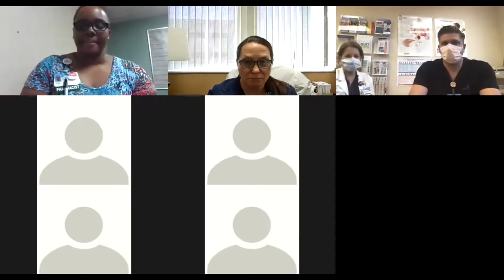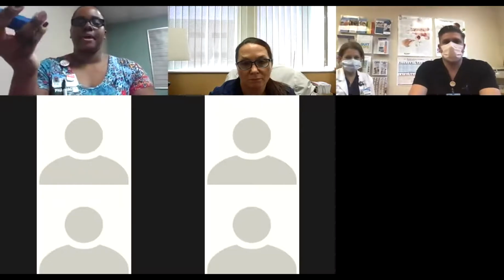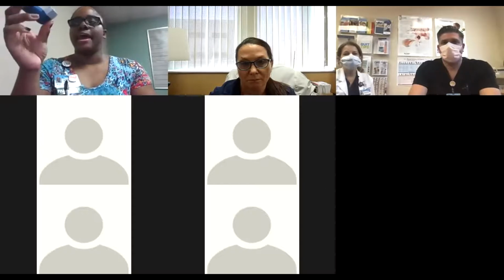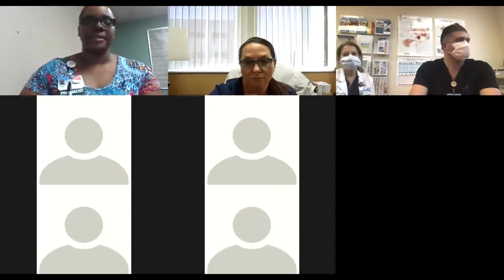And that's pretty much it. That's how you use these inhalers. And you just want to make sure to keep it out of reach of children, obviously. Don't put it in the fridge or anything like that. And just store it at room temperature, in a cool, dry place.